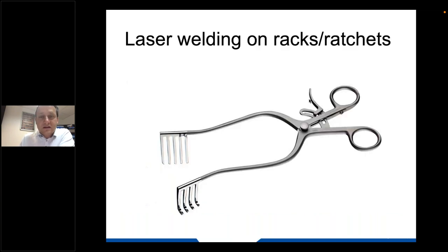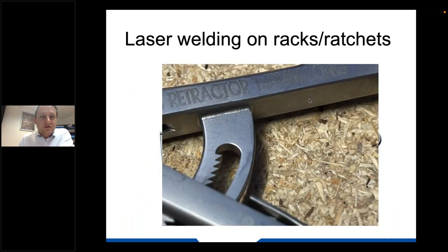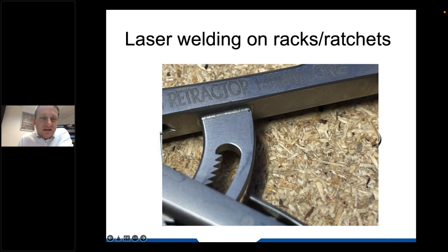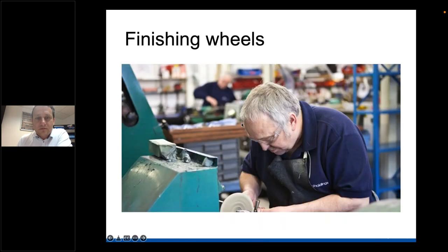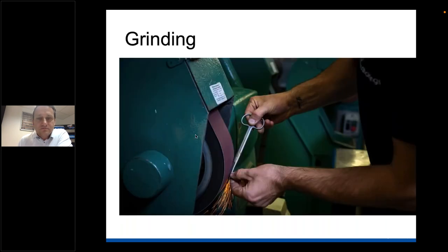Laser welding is something used a lot now on surgical instruments and is a great benefit. Previously, things like the racks on instruments may have been left open with a gap, or soldered - which isn't biocompatible. Now we use laser welding. In my opinion, any gap on a surgical instrument that isn't moving should be laser welded to prevent ingress of moisture, bacteria, and debris. We also use finishing wheels - a scurf wheel is a very rough finishing wheel for taking welds off and dressing welds. Grinding is also used, pictured here on scissors.